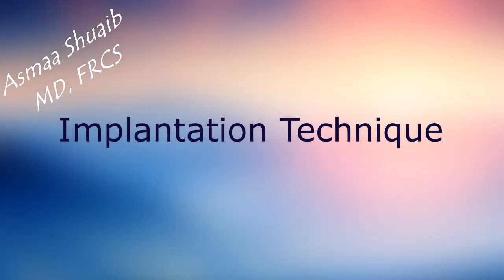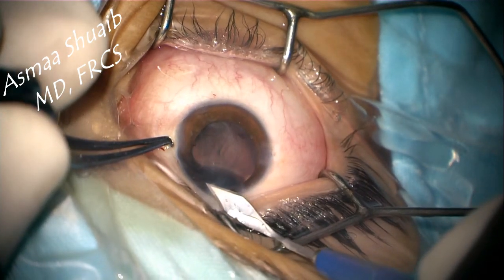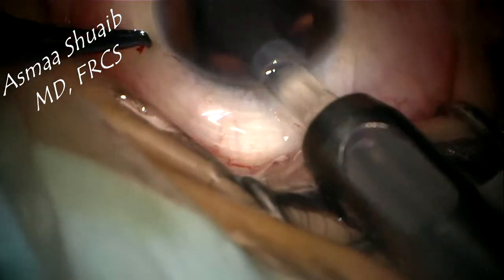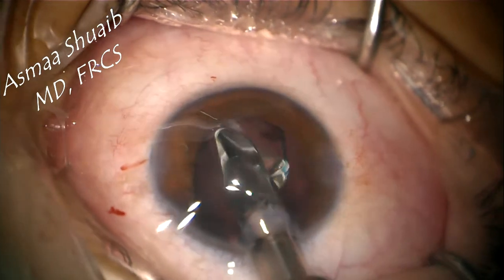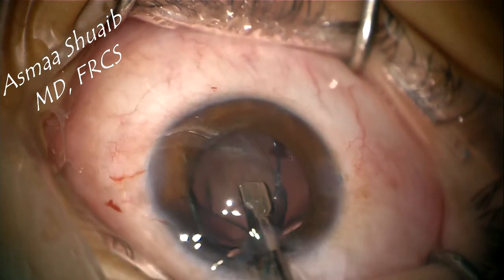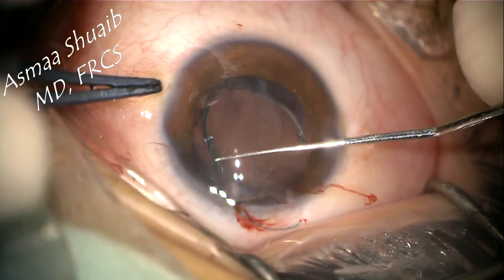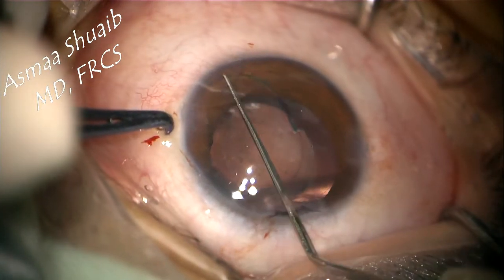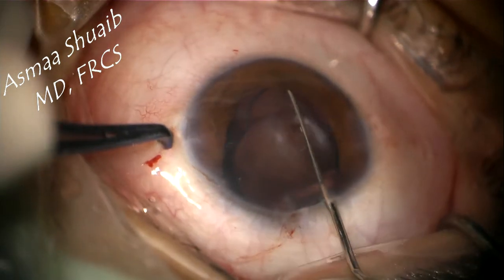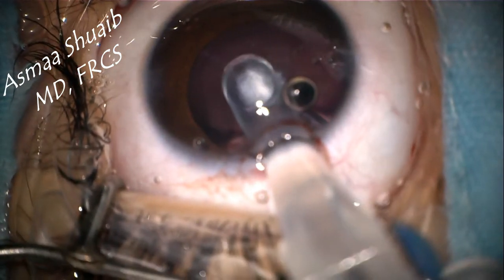Moving to the implantation technique, the wound is usually dilated to be compatible with the size of the injector, which is three millimeters. The key for implanting a three-piece IOL is keeping your eye on the orientation and maintaining the Z orientation. First, rotate your hand to the right side while implanting the leading haptic, and rotate it to the left side while implanting the optic. Then dial the IOL at the optic-haptic junction to get the trailing haptic into the anterior chamber.